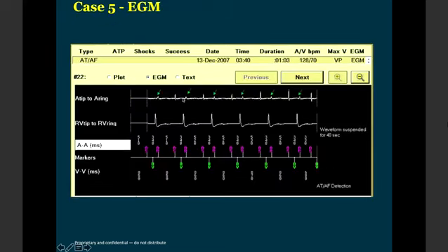As you can see here, this is the atrial EGM that I have shown on top. This is the ventricular EGM. You see here, this is the atrial activity here. Along with the R wave, you see another signal here. So this is the sensing of the ventricular activity on the atrial channel. You can use the word double counting in the atrium. One is a P, the other is a small r from the ventricular activity. The lead may be in close proximity to the tricuspid valve.